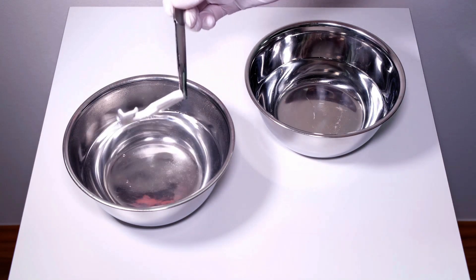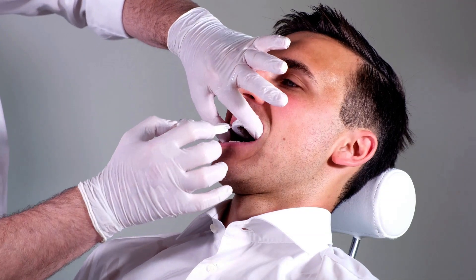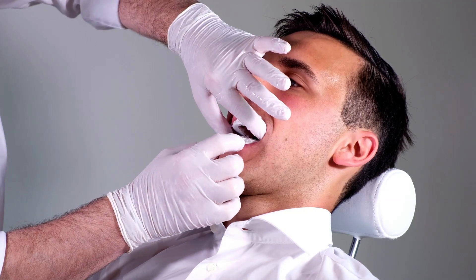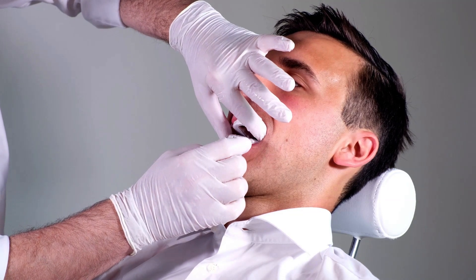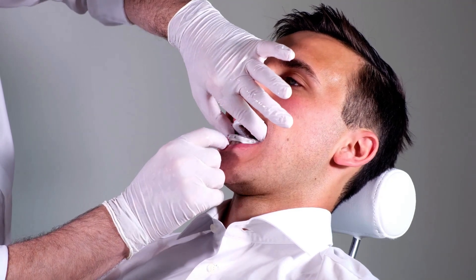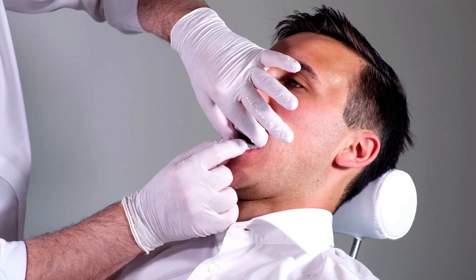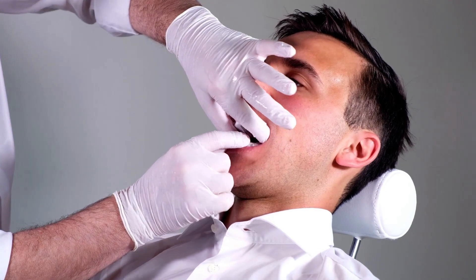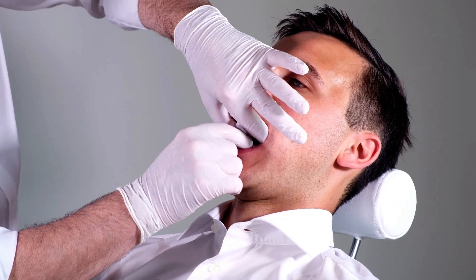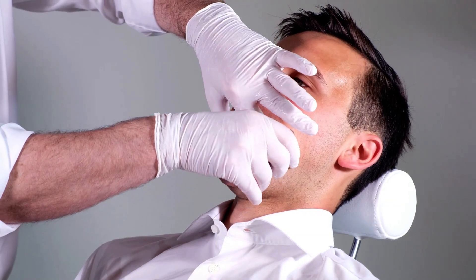Ask the patient to move their lower jaw slightly forward. Place the heated lower tray on the lower teeth, making sure that the line marks on the upper and lower trays form a vertical line. If necessary, the width of the tray can be altered by gently pulling the fixation knobs apart or pressing them together. Keep the tray in place and gently press the thermoplastic material at the outer and inner wall of the tray against the teeth using your fingers.